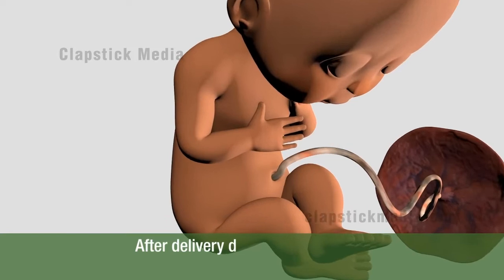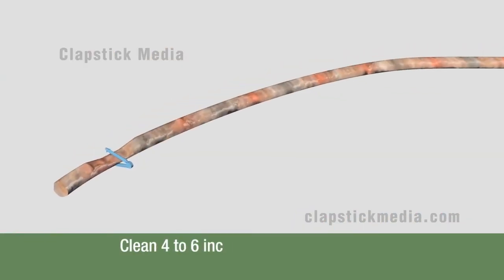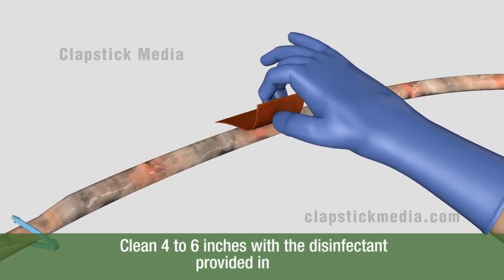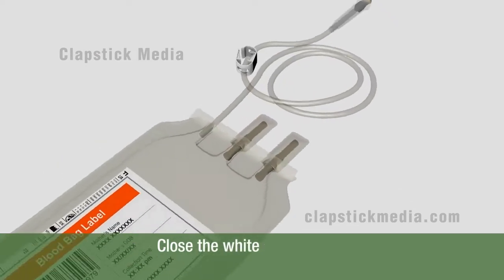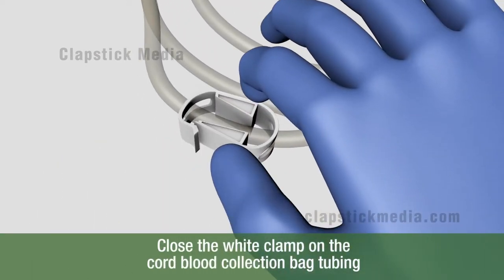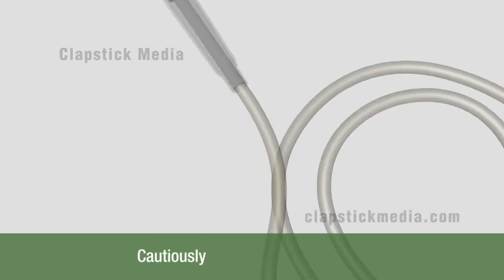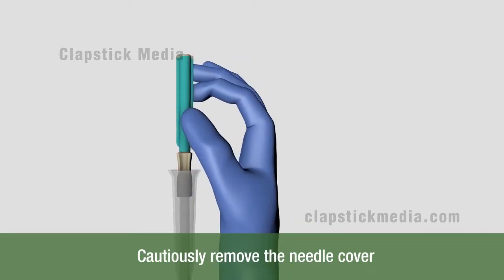After delivery, double clamp and cut the newborn's umbilical cord. Clean at least 4 to 6 inches with the disinfectant provided in the kit. Close the white clamp on the cord blood collection bag tubing to maintain a closed collection system. Cautiously remove the needle cover by twisting and pulling it upwards from its base.